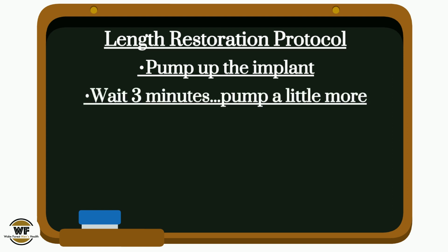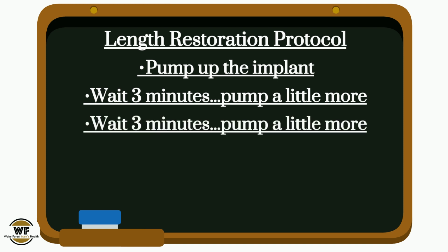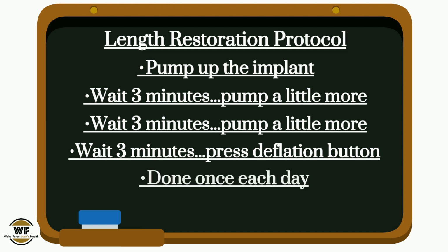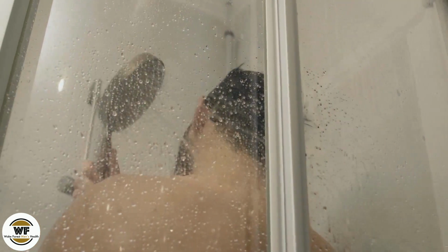Wait 3 minutes and then try to pump a little more fluid as allowed. Wait 3 minutes again and try to add a little more. Wait another 3 minutes and then press the deflation button to bring the implant down. This 10-minute cycle can be done once each day, and many men find it easier to perform during or after a hot shower.